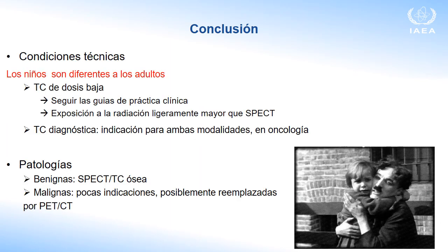Now, what are the take-home messages? First of all, regarding the technical condition, of course, children are different from adults. Using a low-dose CT, we have to follow the guidelines, in particular in the administration of the correct radiopharmaceutical at the correct activity.